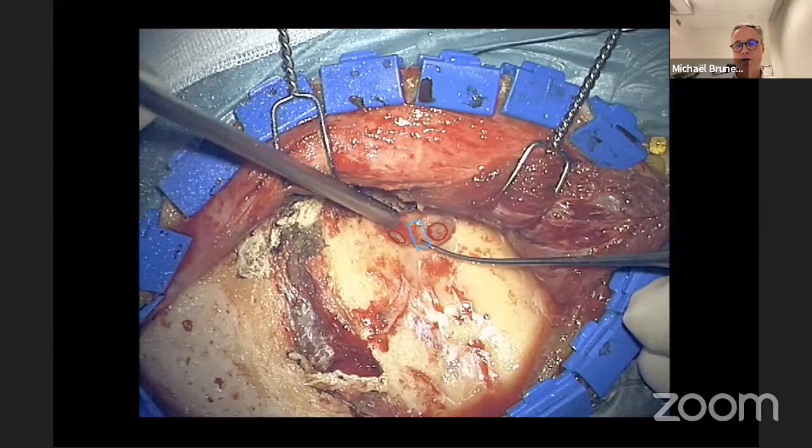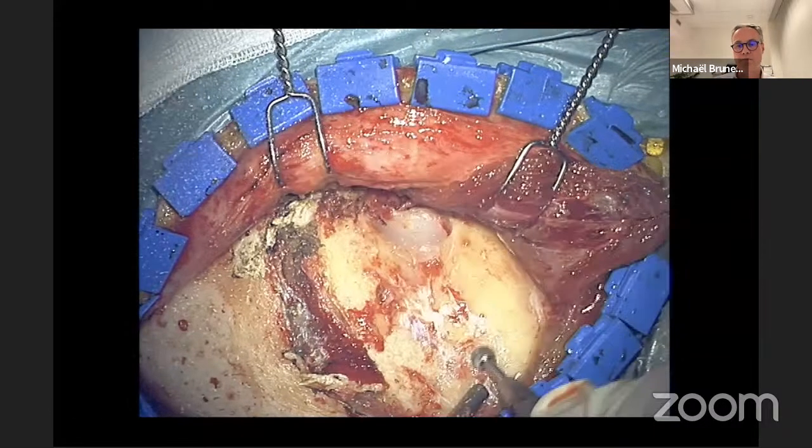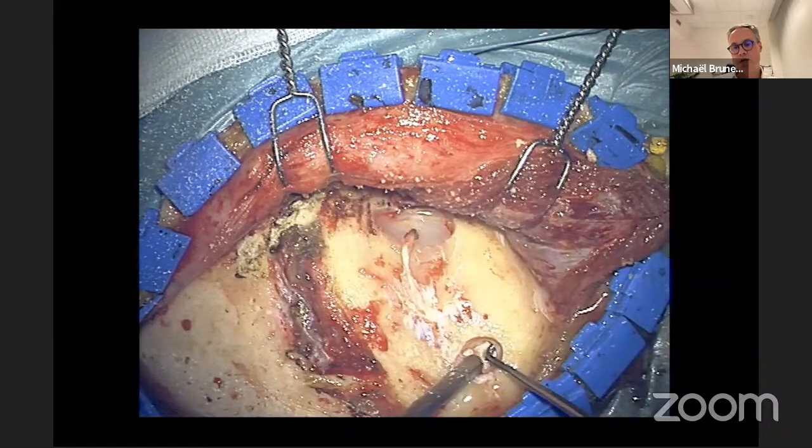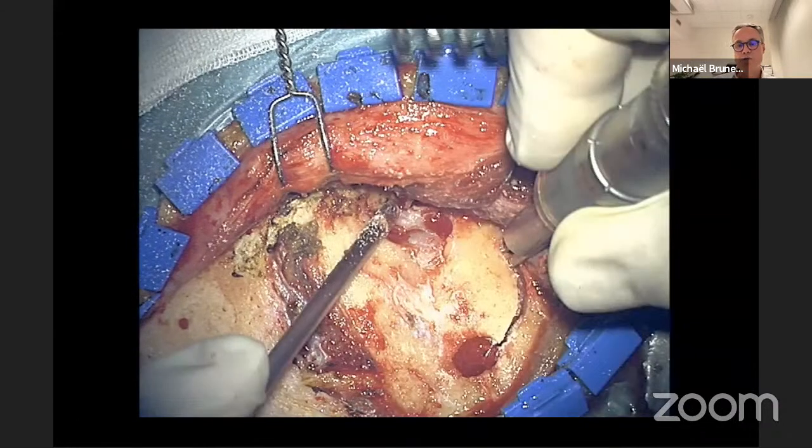You see here the temporal dura mater, the frontal dura mater, and the crest in between that can be released very easily with a gouge. Then I make a posterior bore hole, expose the dura, and just place a hook. I don't detach the dura mater all over the craniotomy size, just at the beginning to place the craniotome. And then I use 4 cuts.